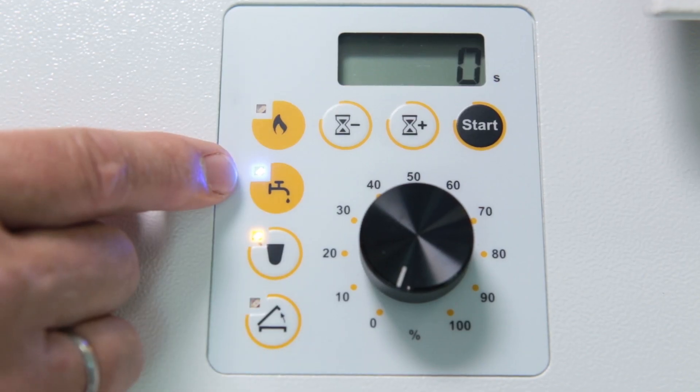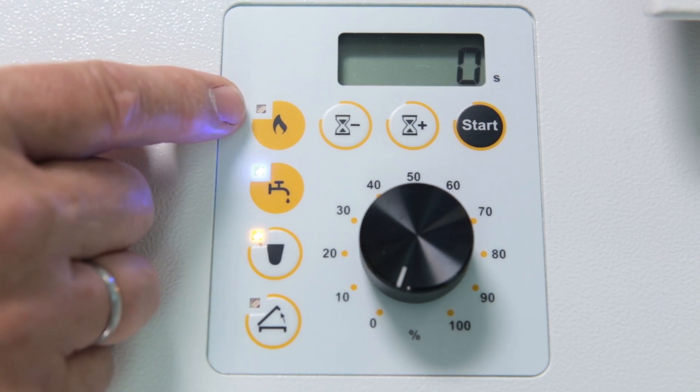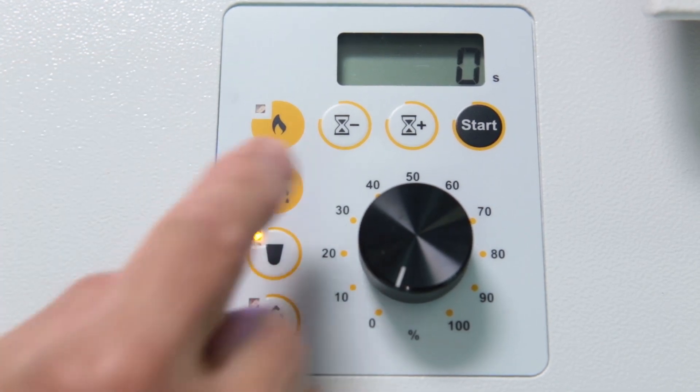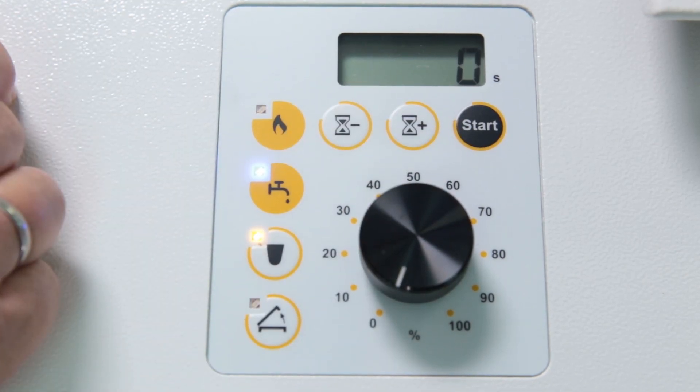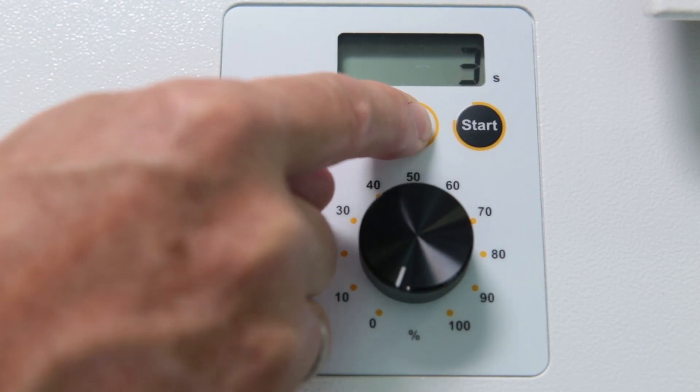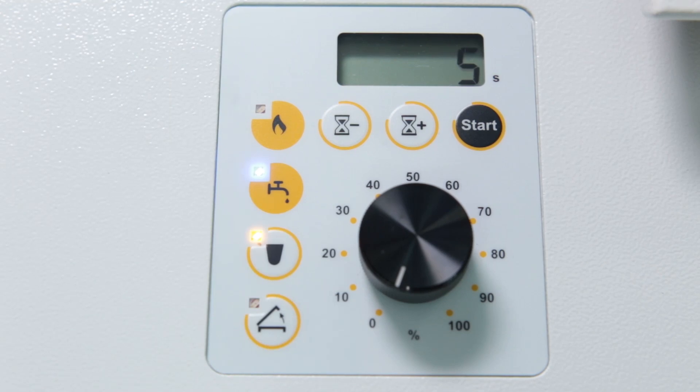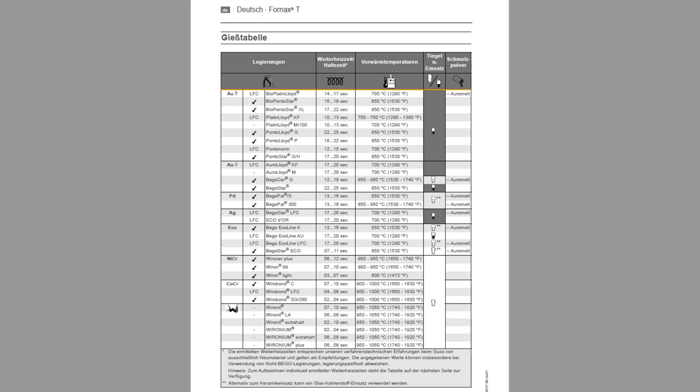This button signals whether the cooling system is working properly. The upper button will later show if the heating process has been activated. The hourglass sets the alloy-specific reheating time. For example, 5 seconds like in this case. The time can be entered individually with the plus and minus buttons. An overview of the alloy-specific heat-up times is included with each device.